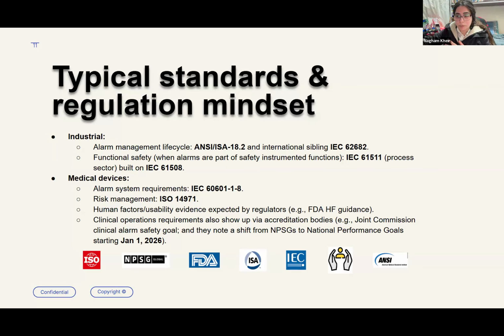As we mentioned before, when we went through the priorities, the classes, and the types of the alarms, we talked about things that we will help the operator with by bringing them ADaM and Krake.